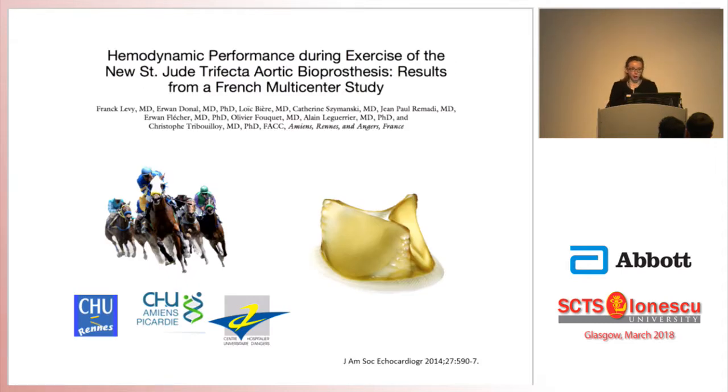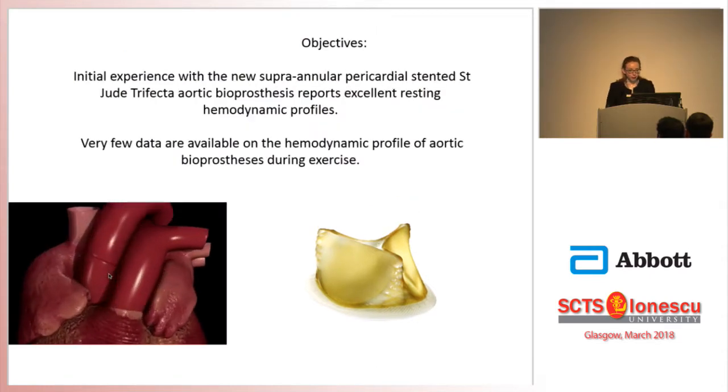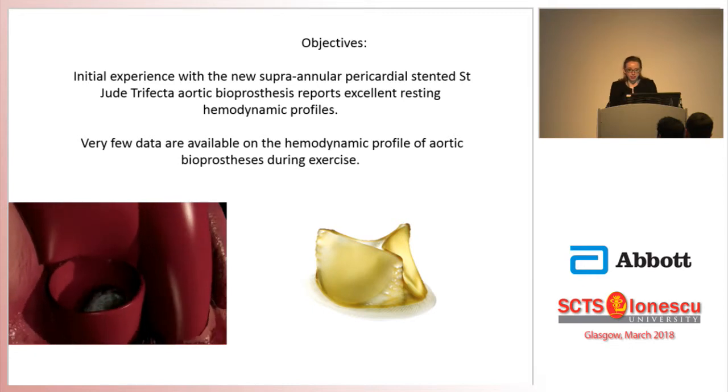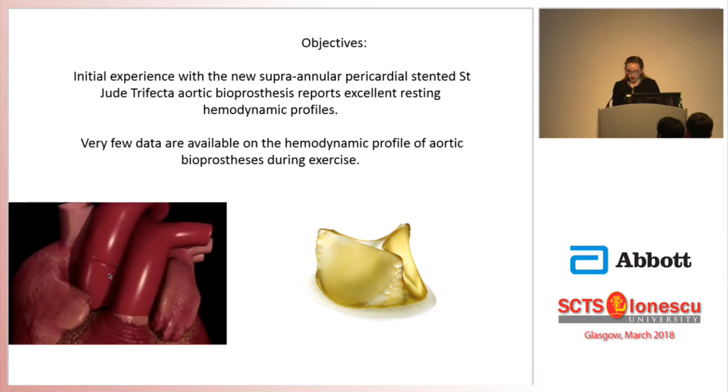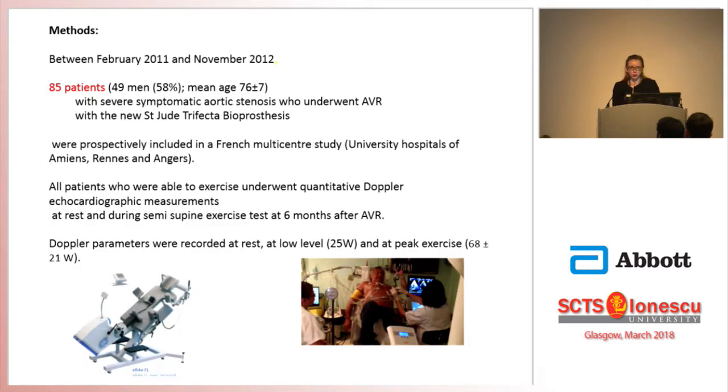In our study, we wanted to evaluate the hemodynamic performance during exercise, based on the fact that there were excellent reports at rest and few data available on the hemodynamic profile during exercise. So between February 2011 and November 2012, 85 patients with severe symptomatic aortic stenosis got aortic valve replacement with the Trifecta in 3 centers in France, Amiens, Rennes, and Angers, and all of them who were able to perform an exercise underwent a quantitative Doppler echocardiography at rest, low level, and peak exercise.